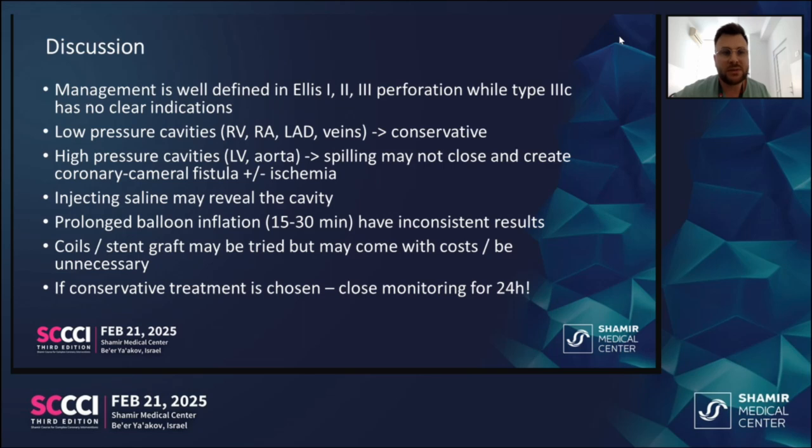From our experience, perforations into low-pressure cavities, like the right side, you can just leave alone, and high-pressure cavities like the LV or aorta, the spilling may not close and actually create those kinds of fistula, and on long-term follow-up, they can induce ischemia by coronary steal. Injecting saline may reveal the cavity. Prolonged balloon inflation has inconsistent results. Like I told you, I've read many reports about ballooning for a long time, let's say keeping the balloon for 1 hour. It doesn't really work.